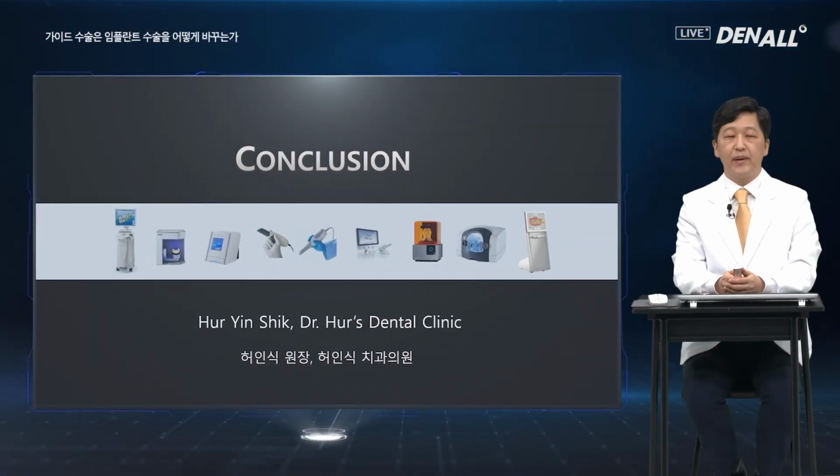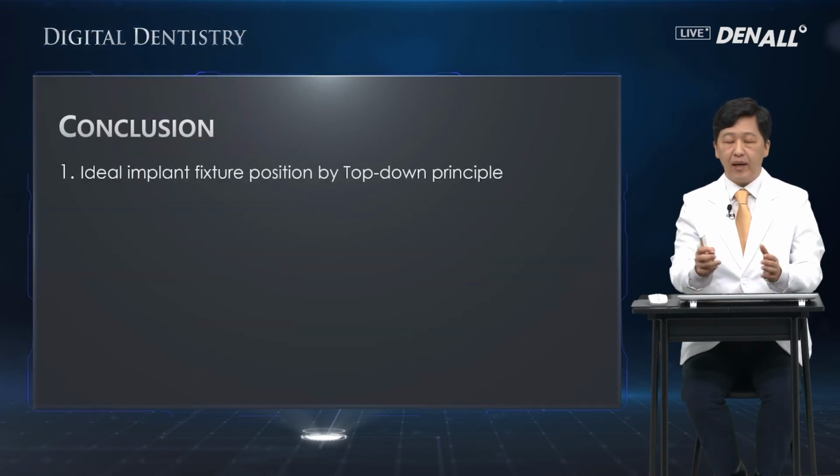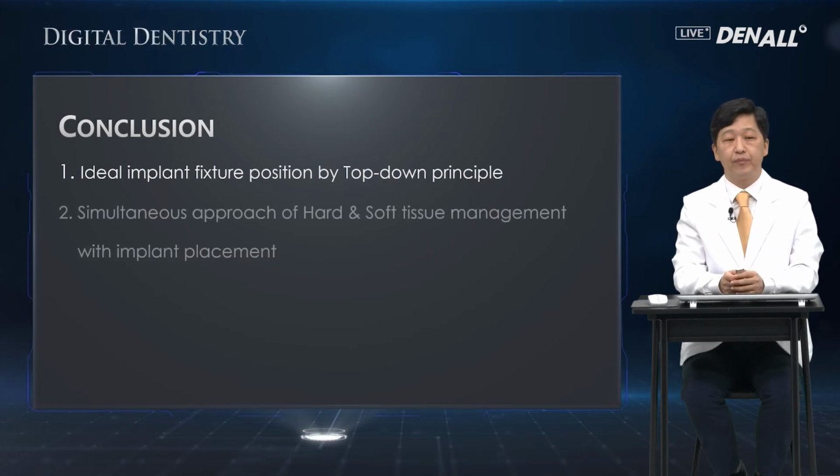I would like to move on to the conclusion. When you use guided surgery, you can use the top-down principle. Place the implant following the ideal crown position. You can place the implant in an ideal position as well.